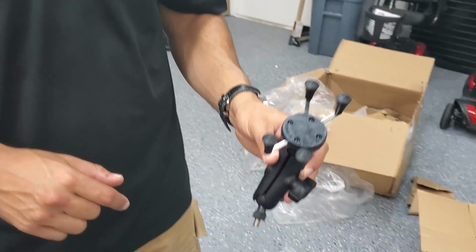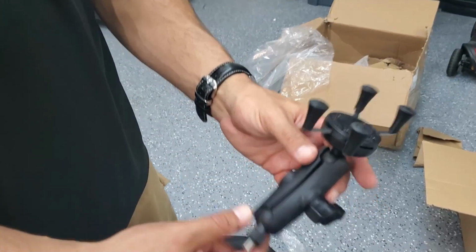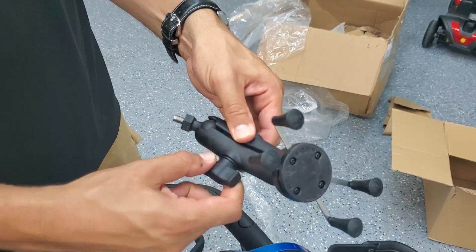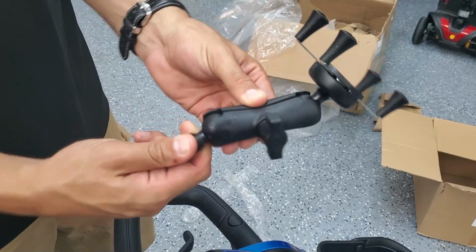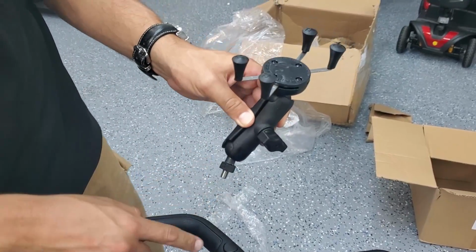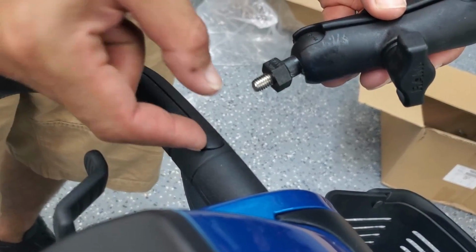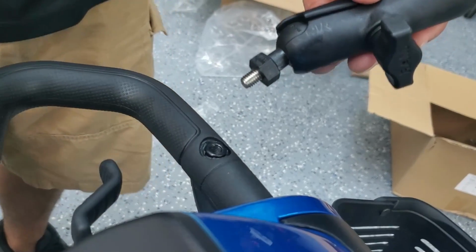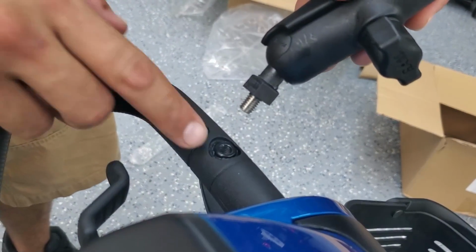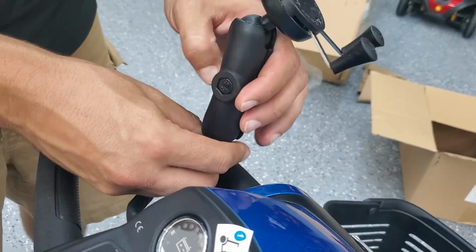All right, so here I've got the cell phone accessory which came with the scooter, and in order to work this, you're gonna have to kind of see how it works. There's a tension knob here which I'm gonna release. That allows you to wiggle and change the position of the holder from the base, which screws in right here underneath this little circular cover. You can pick it up, lift it up, and you can expose the threaded insert hole for this bolt to thread into. So you just kind of line it up and start to twist.